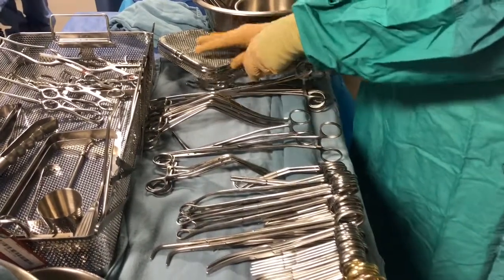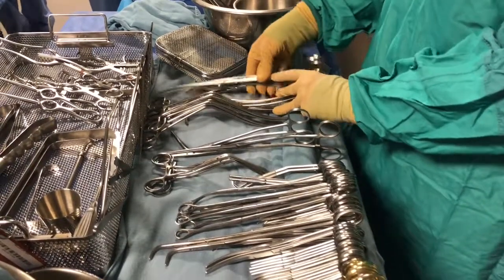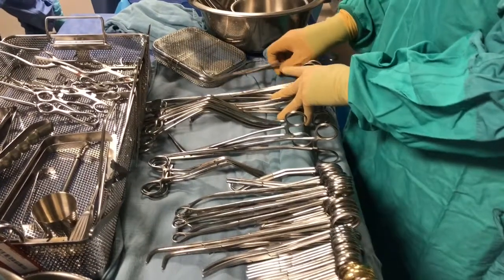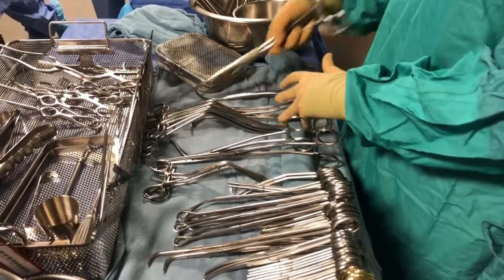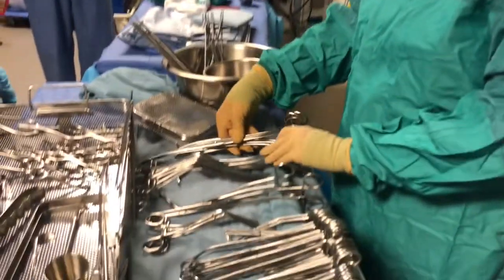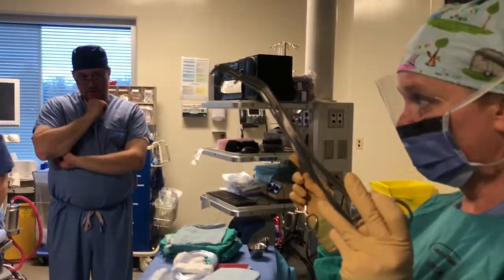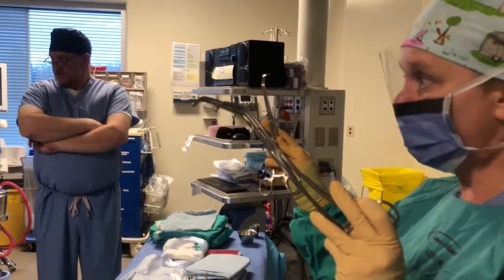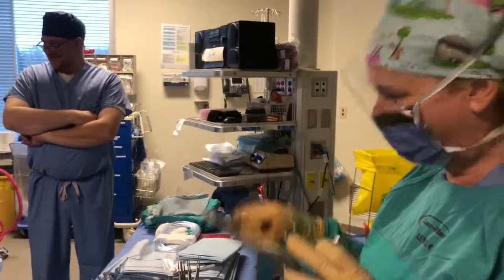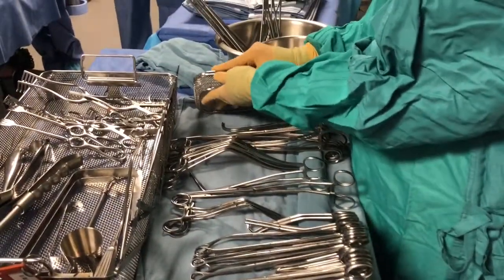What were the smaller ones that you closed and turned around? Oh, yeah. Debakeys. Yeah, rotation. And that big S one is called, this one? That's that one, yeah. This one's a SEMB. S-E-M-B. It looks like an S and a B. I don't see it this time. I saw it 2 years ago. I don't see it now.